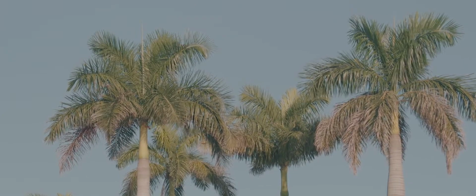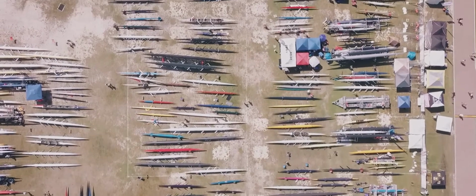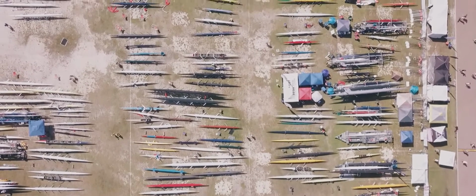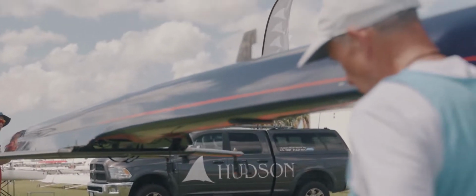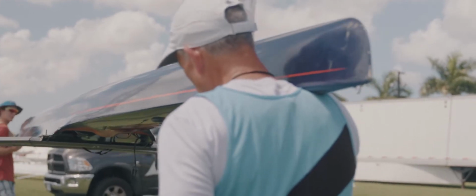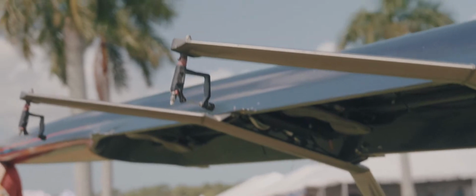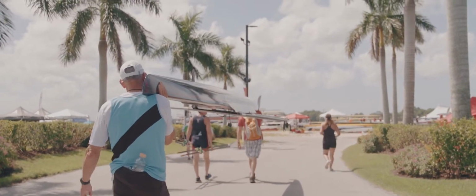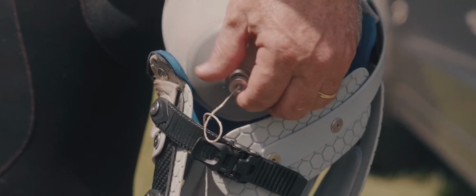My first prosthesis was a carbon fiber hard socket. What would happen each time is it would get very loose, and you'd have to use lots of socks. And then when I would row, my leg would hypertrophy a little bit, and then the socket would really hurt. And the problem with a hard socket is the edge of the socket digs into your groin, and when you row, you want to lean way forward, and it would dig in and restrict my motion, but nothing would relieve that.